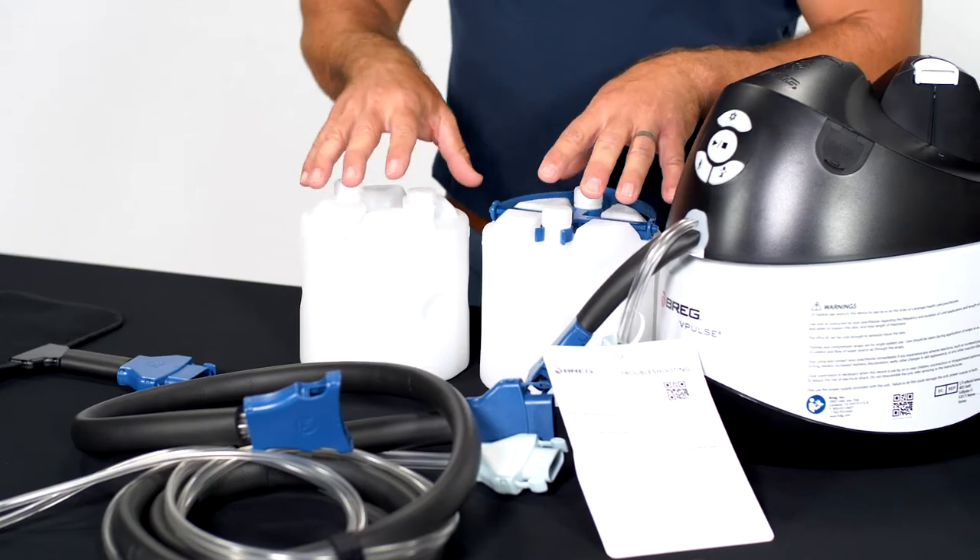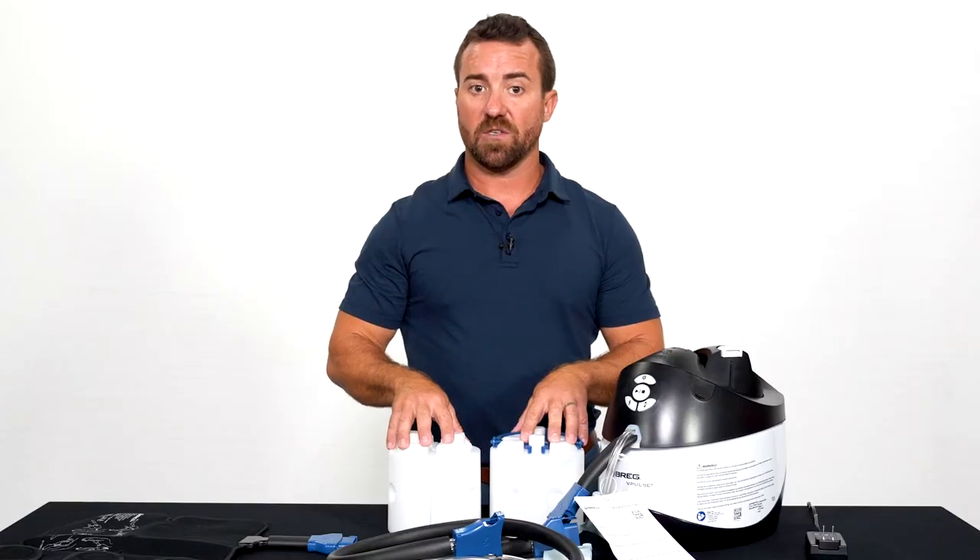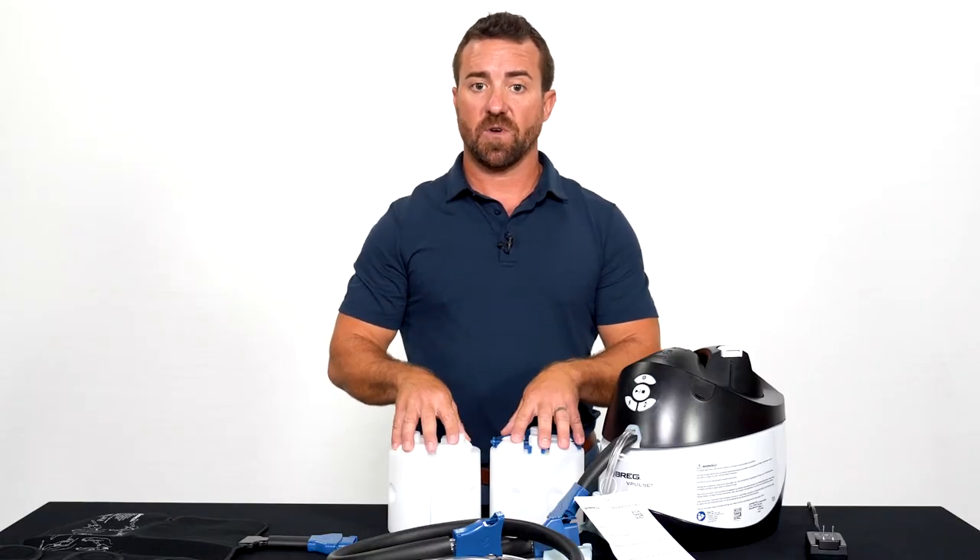The night before your surgery you want to make sure you fill up all four of these canisters and put them in the freezer to freeze so they're ready when you return home from surgery.